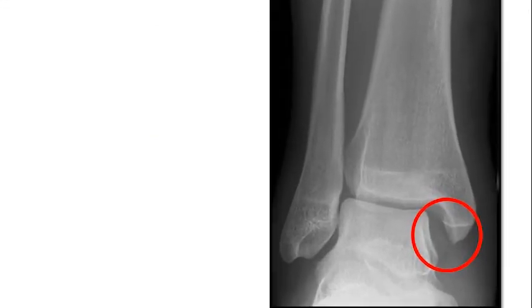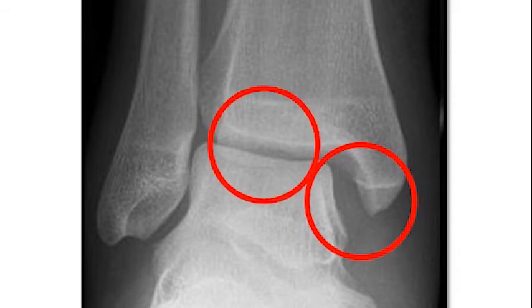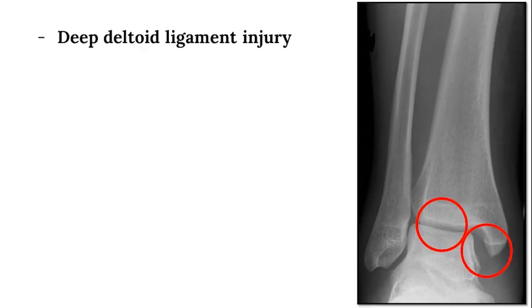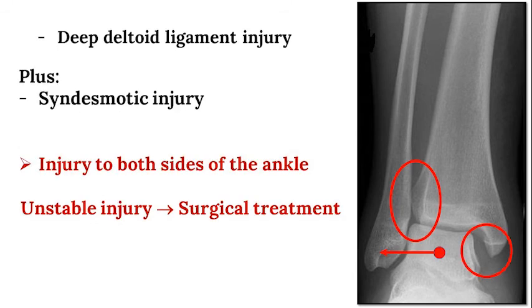While no obvious fracture is present on these x-rays, the medial clear space is significantly wider than the superior clear space, indicating a deep deltoid ligament injury. Additionally, the tibiofibular overlap is decreased while the tibiofibular clear space is increased, indicative of a syndesmotic injury. The x-ray demonstrates lateral translation of the talus within the tibial plafond. Given the lateral and medial sided injuries, this is unstable and requires surgery.